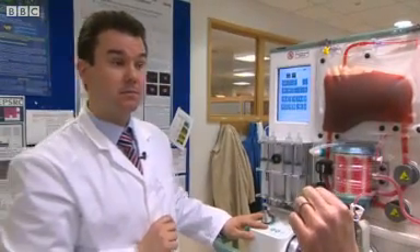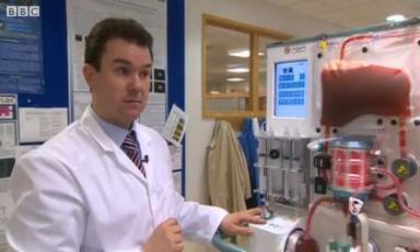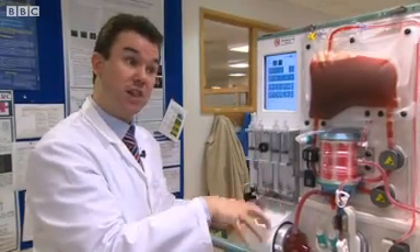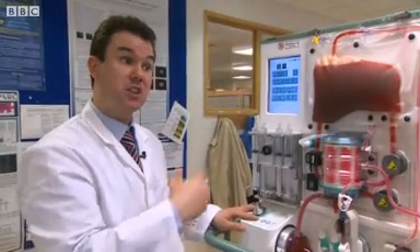Do you hope it might mean more livers will be available for transplant in the future? Absolutely. About half of the organs currently available in the UK within current donation practices come from riskier marginal donors. We believe that these organs can be both improved and, most importantly, assessed on this device. Therefore we could as much as double organ availability within current donation practices.